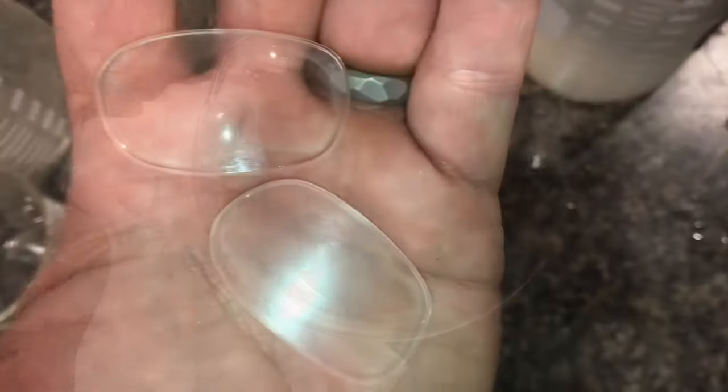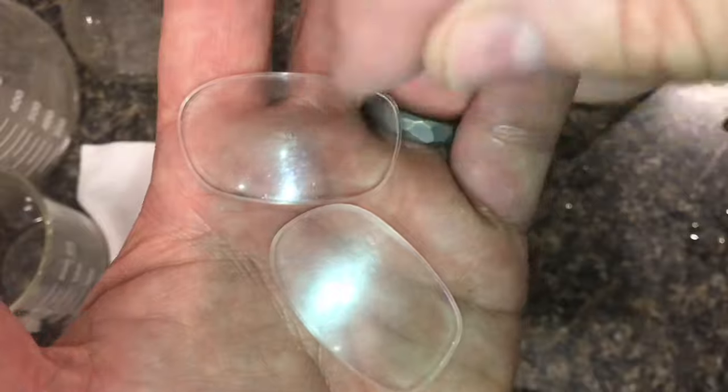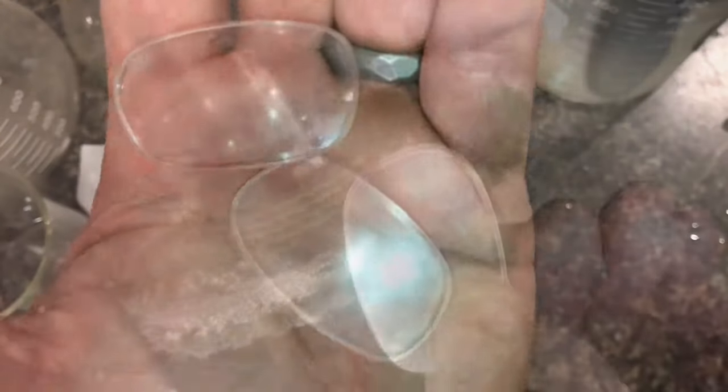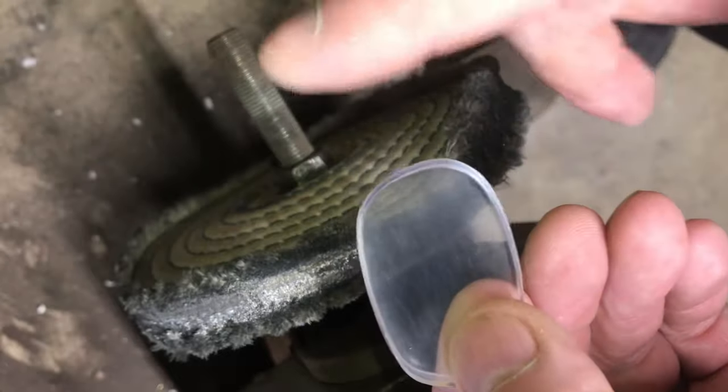Keep scrubbing it, keep it wet. Here's the lens with the toothpaste — you can see a little bit of haze. Here's the one we have not touched yet. You can see that the scratches are gone, but there is a little bit of haze, so we'll buff it up.